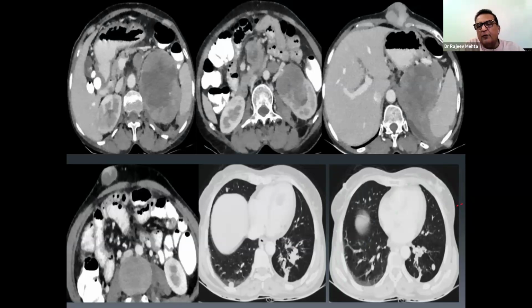So even if you are following up your patients for RCC on a regular yearly basis, it will be advisable to include a CT chest along with the abdomen and pelvis scan to pick up a small suspicious lung metastasis, which may at times be missed on PET scan.